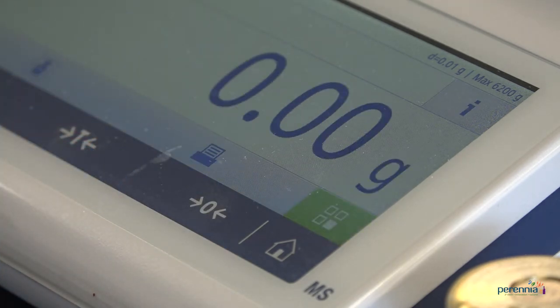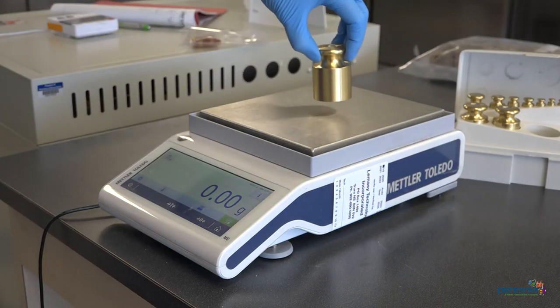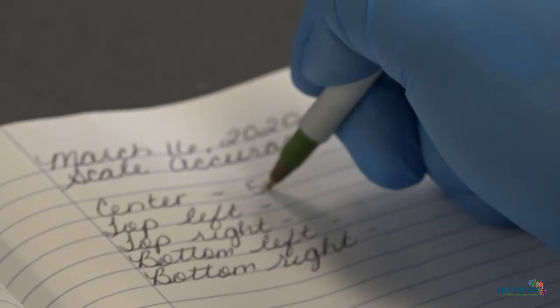Step 3: place the known test weight in the center of the scale. Record your findings.